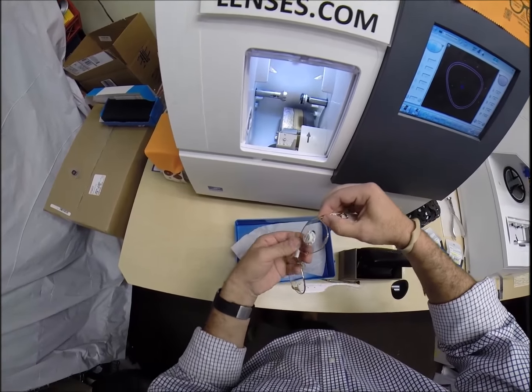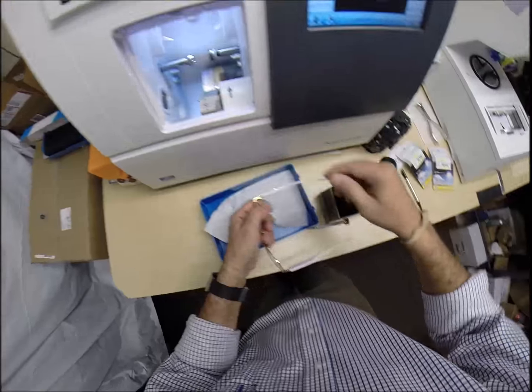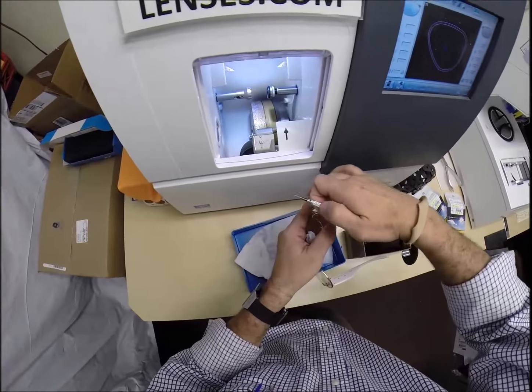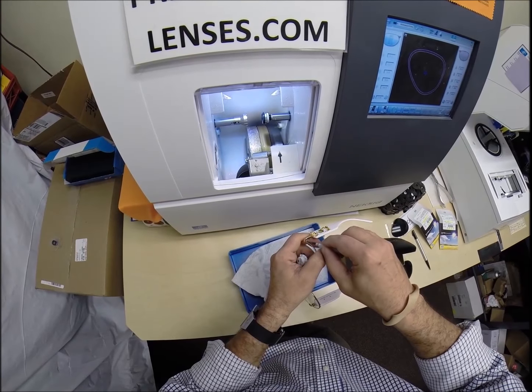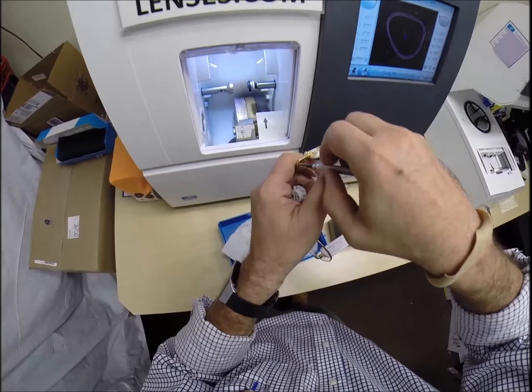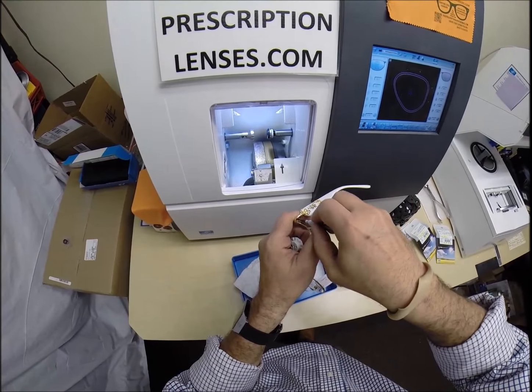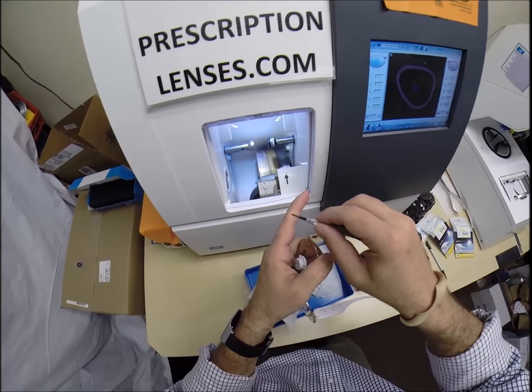So I'm going to put my thumb on there, make sure the lens is in there everywhere. That is good. Keeping my finger pressed down to clamp everything together. Use my Phillips head. I'm going to do a little bit of righty-tighty. Now every optician would tell you this is a terrible thing because if the screwdriver slips, you're going to stab yourself in the finger. Every optician has a callus right there from that happening.